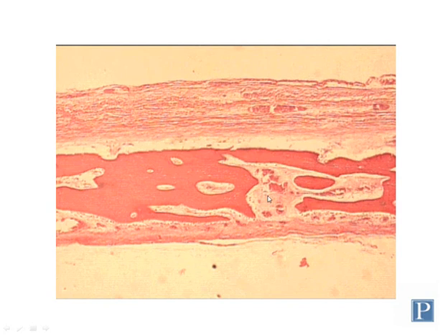So it has lots of holes in it, kind of like Swiss cheese, and the holes are the whiter, paler areas, and the dense bony matrix, which in this type of bone is composed of trabeculae, are the eosinophilic structures. So it's important to remember this, because sometimes you want to think of bone as being light or yellowish in color, and that's only true when you're looking at bone that hasn't been stained.